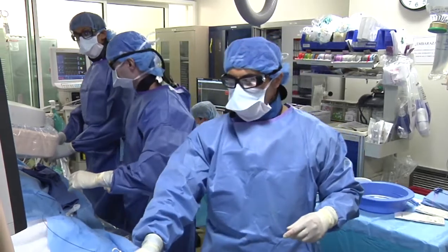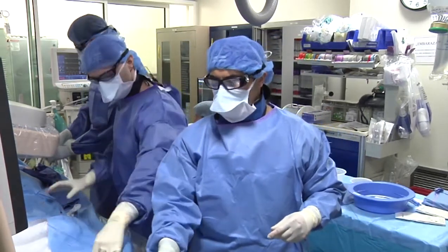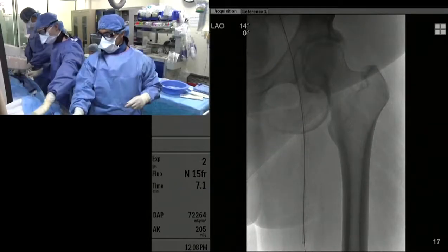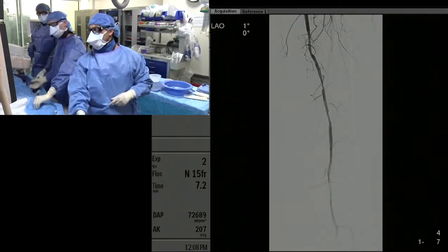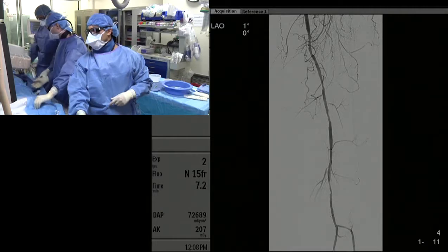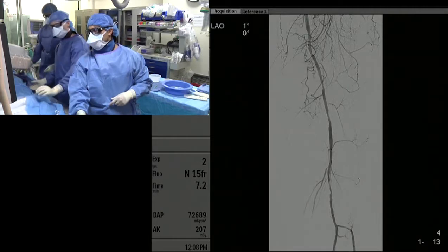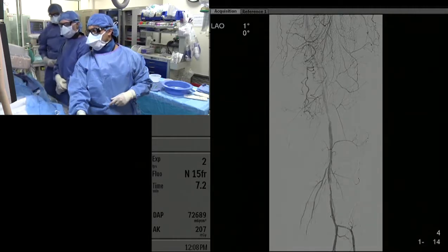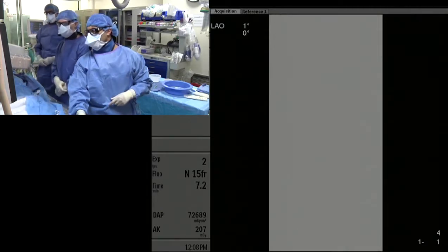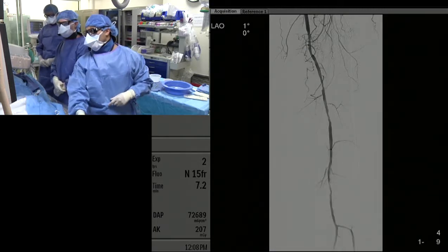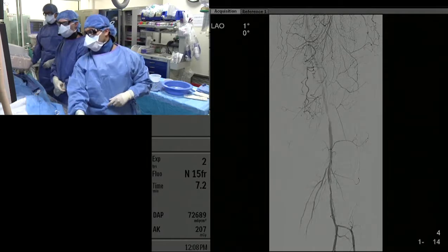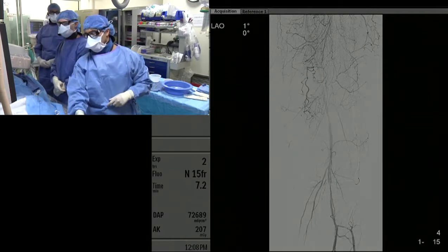Going through the angiogram — you can see the distal SFA and popliteal artery, which has several areas of moderately severe stenosis. The bulk of the lesion is actually in the popliteal artery.